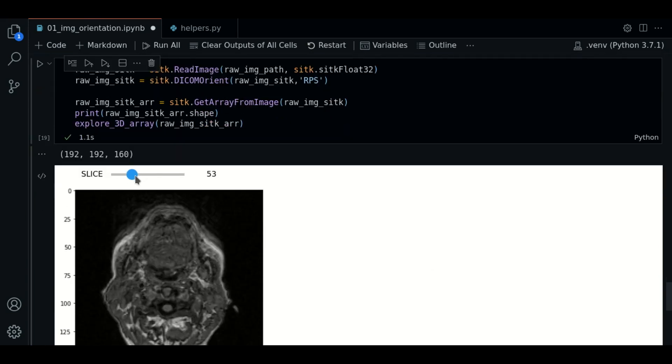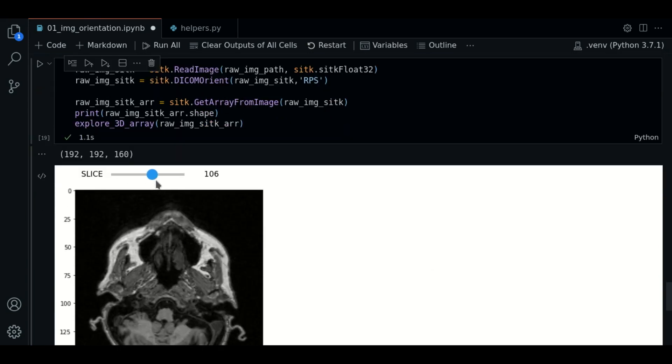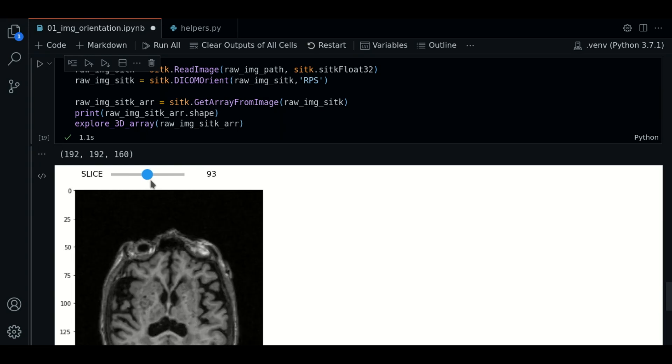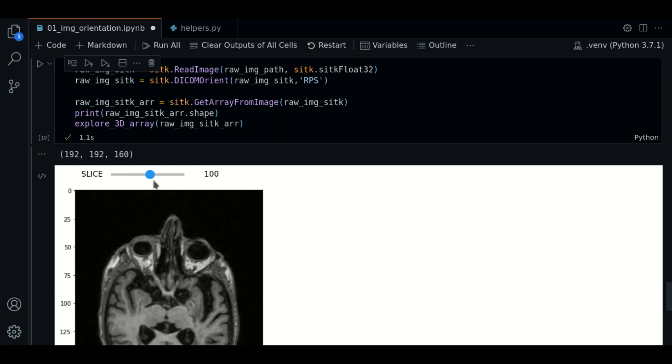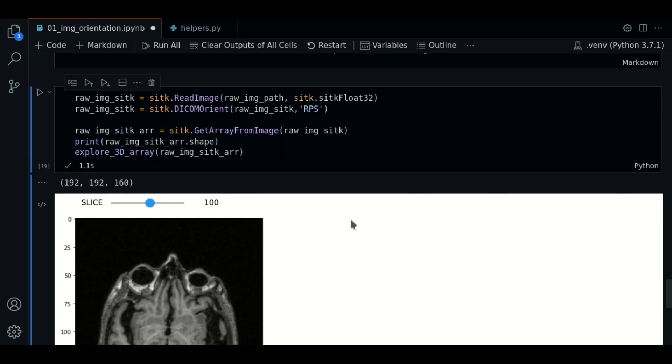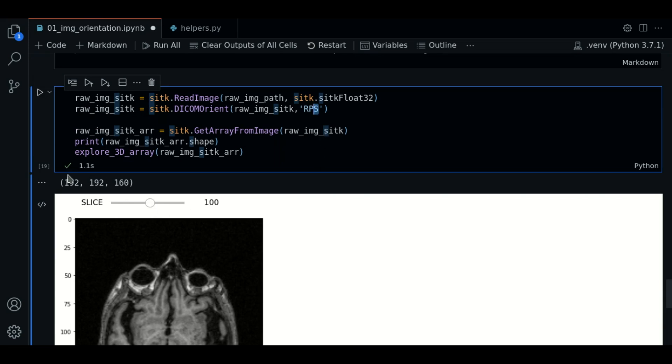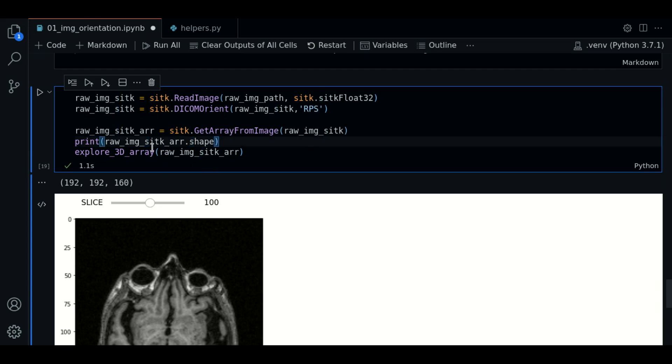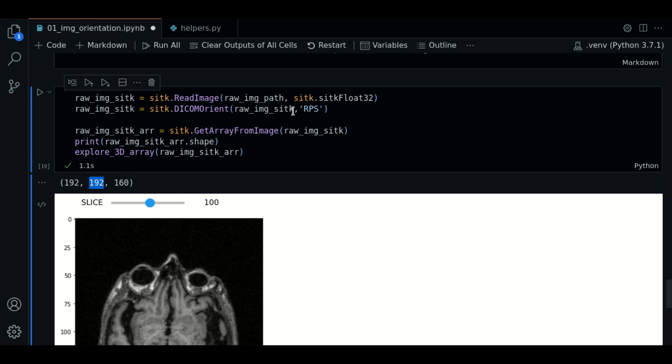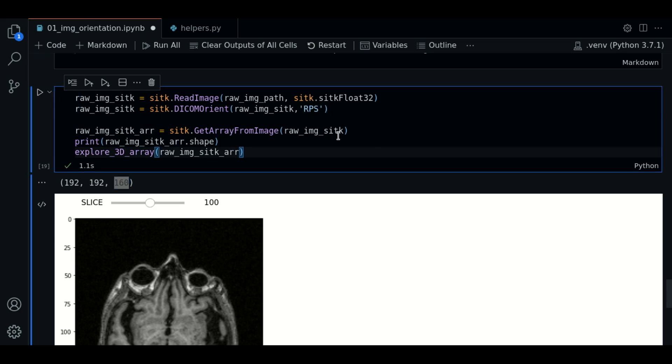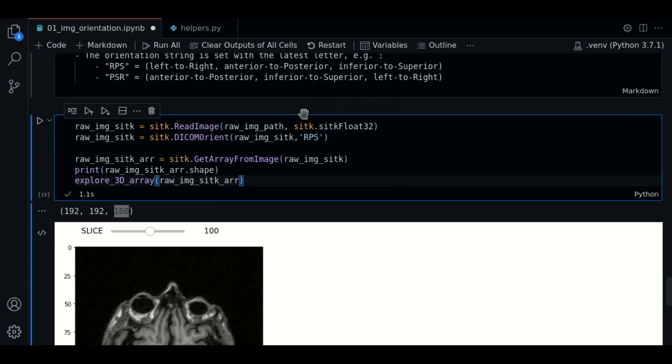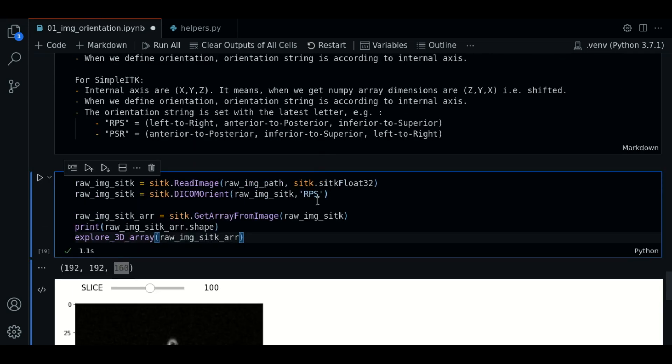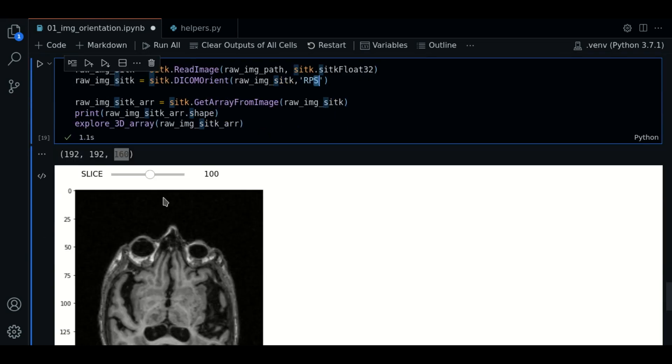So, we have our image. If we want to make sense of this, we can say that the last letter dictates the orientation of the first dimension. The second letter dictates the orientation of the second dimension. And the first dictates the orientation of the last dimension. So, this is shifted.